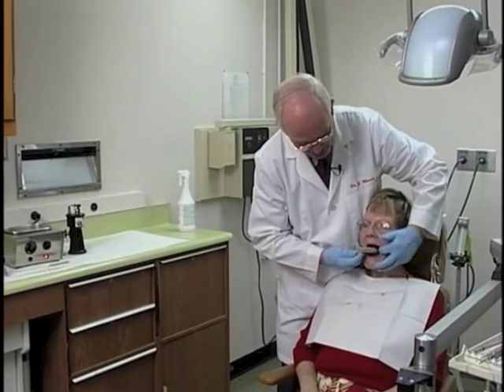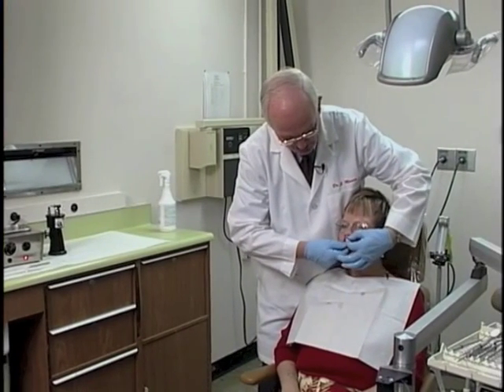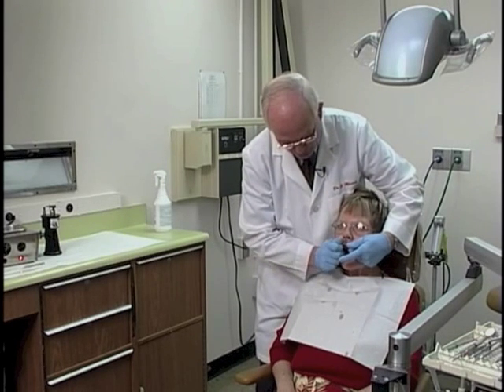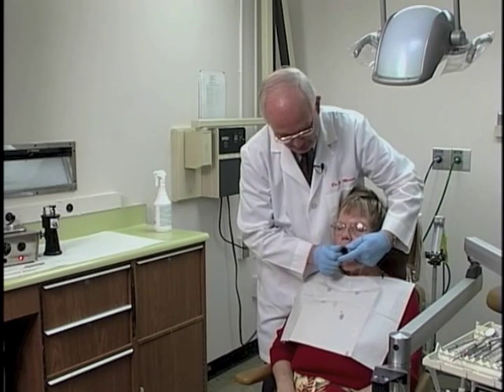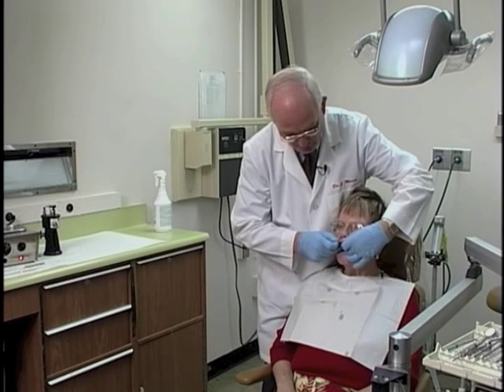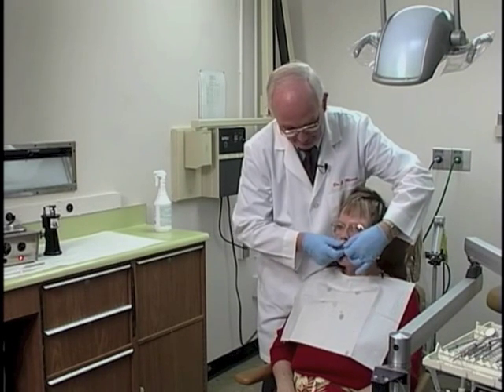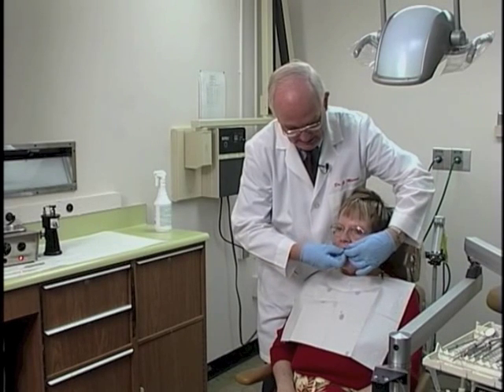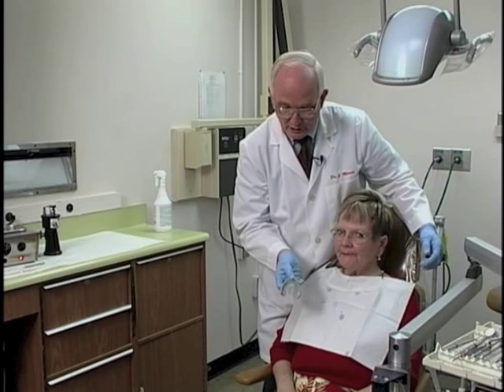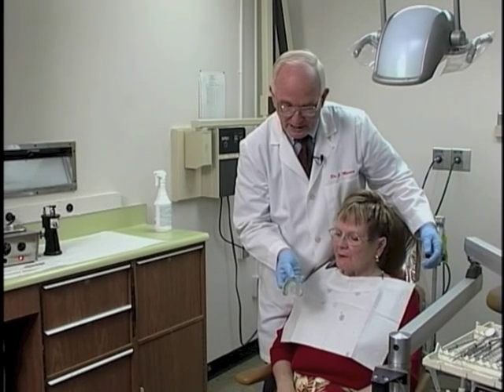Then we go to the mouth, seat the tray all the way, and this time we want to border mold each buccal frenum area on left and right sides, and for the labial we're going to just pull the lip straight down. And there we have our border molded tray, all except the posterior palatal seal area.